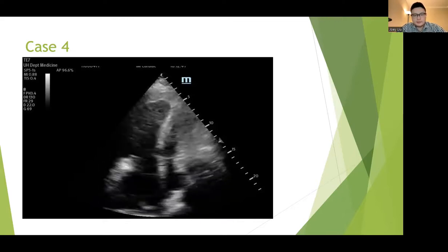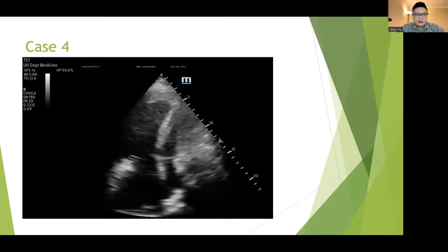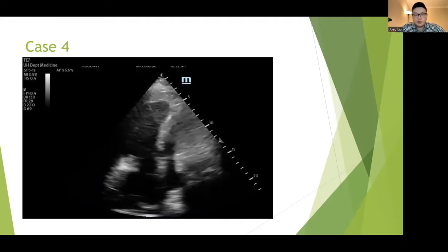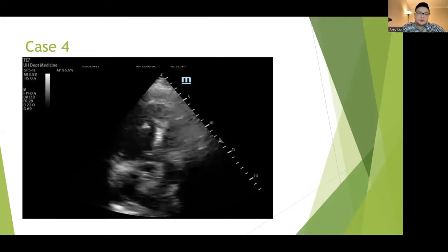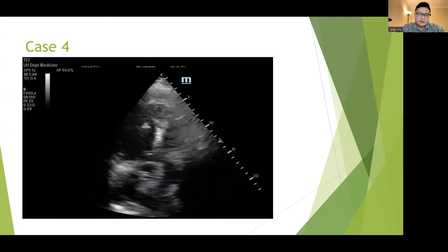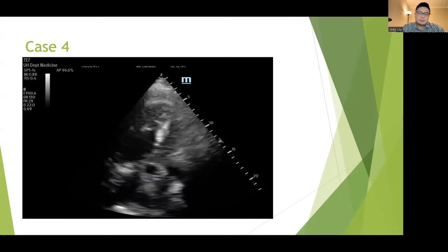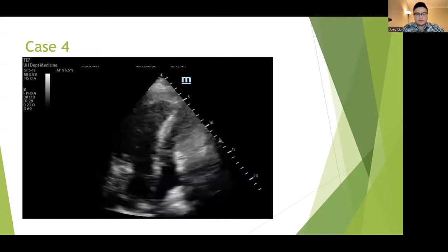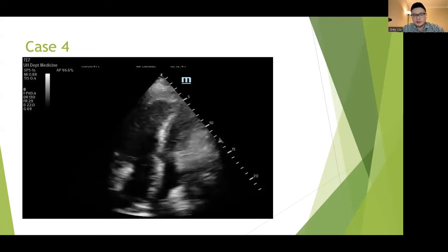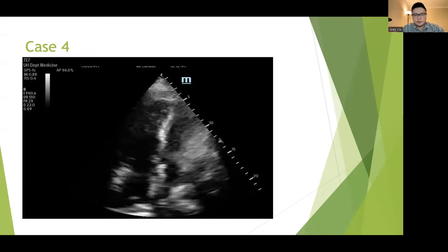And just for everyone, what I have learned so far in POCUS is that RV septal flattening during diastole suggests RV volume overload, whereas RV septal flattening during systole suggests RV pressure overload. So we feel like from these images, this seems to be the case during both systole and diastole, and therefore we think there's presence of both RV pressure and volume overload for this patient.